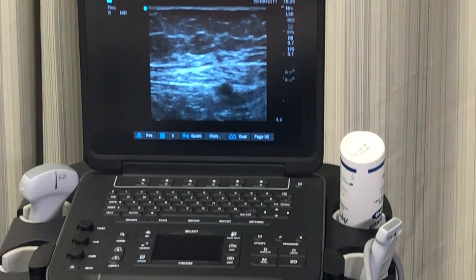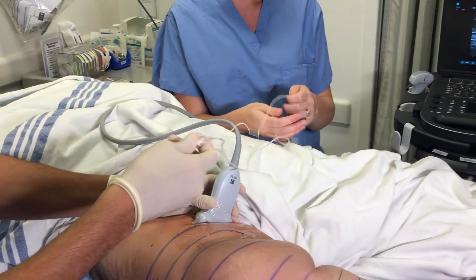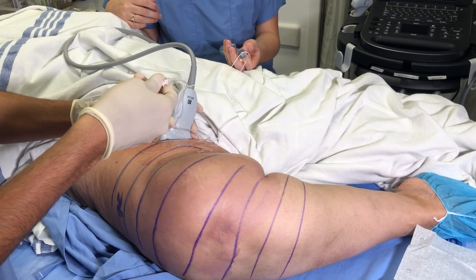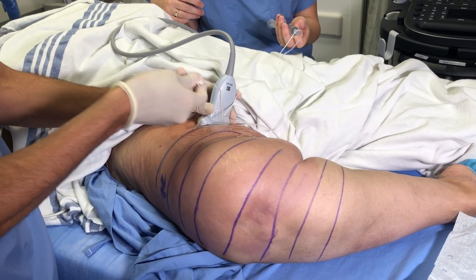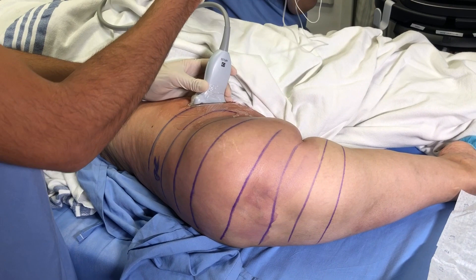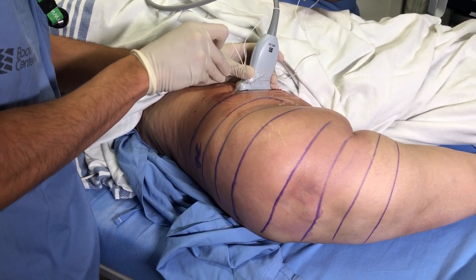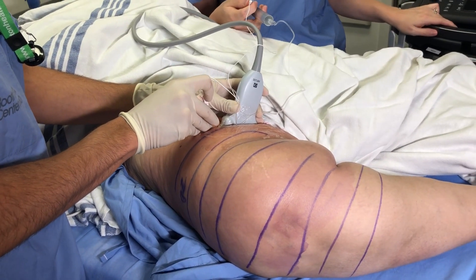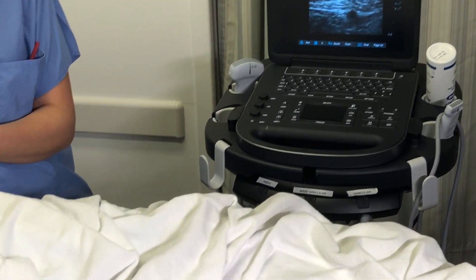In my left hand you can see this probe — that's an ultrasound machine; it helps me recognize the anatomy. And in the other hand, we have the needle. We've already performed a spinal anesthetic, so the skin is already numb, so this should not hurt at all. Sometimes people will put some freezing in the skin to also reduce pain from the injection. You're going to feel some pressure in your leg here.